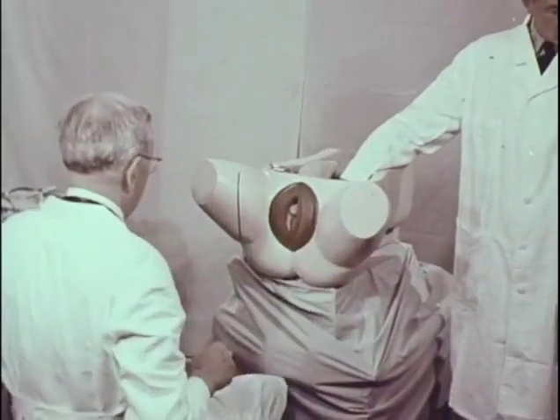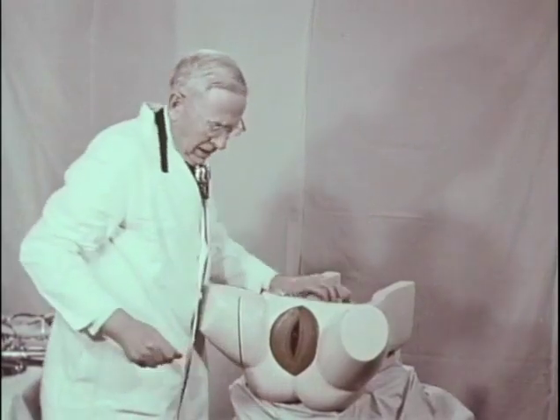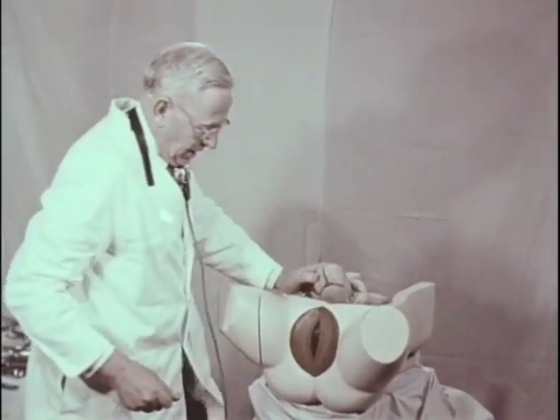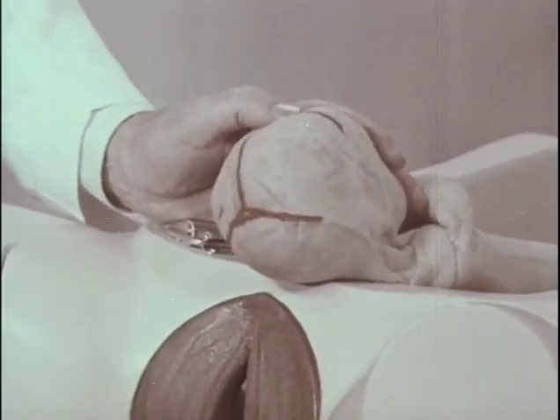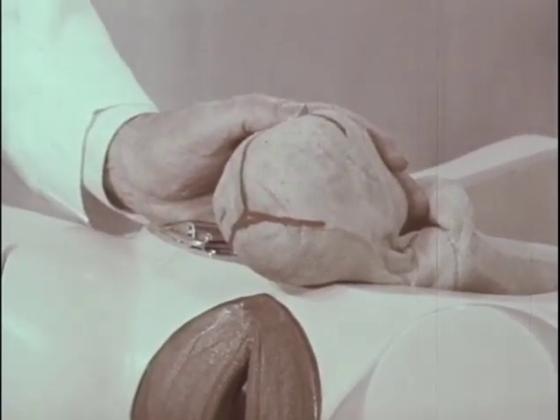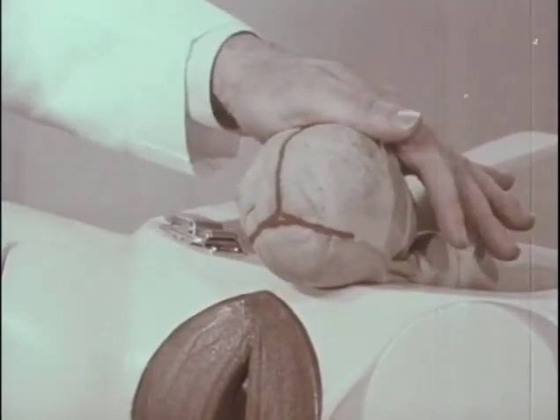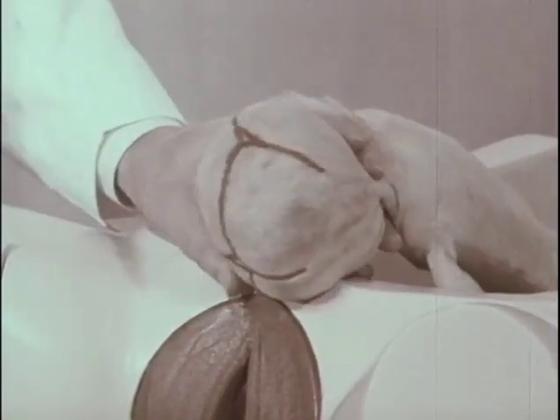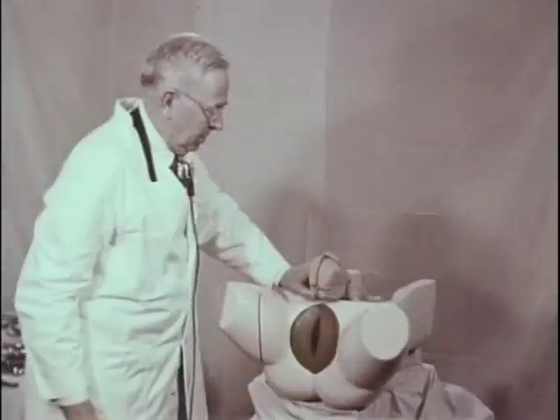The other complete instrumental rotation of an occiput posterior is the Dennen key and lock maneuver. It differs from the Scanzoni maneuver in that it is a gradual rotation of the occiput posterior with multiple manipulations over an arc of 135 degrees or more to anterior, and it is done with the Dennen-Simpson type of forceps.